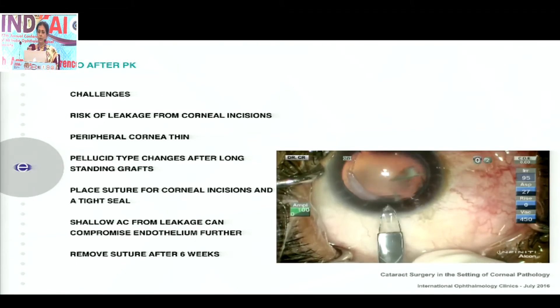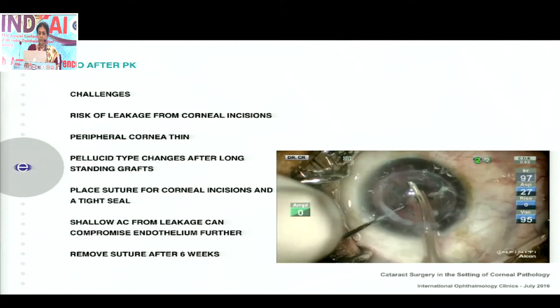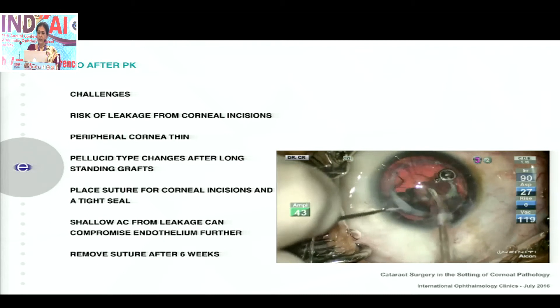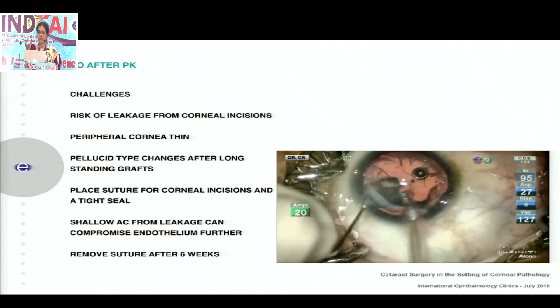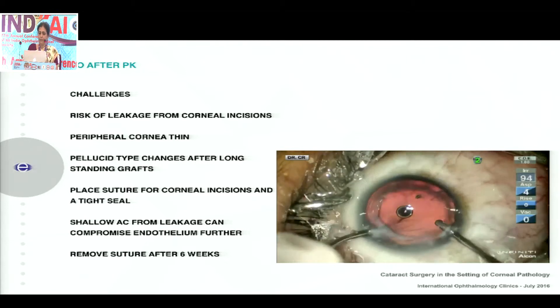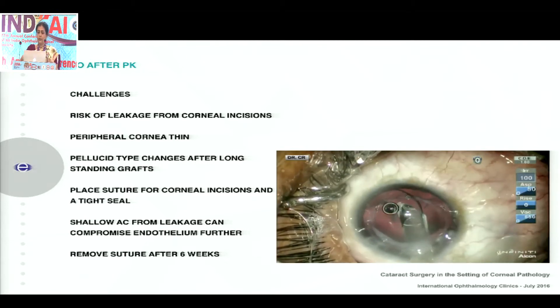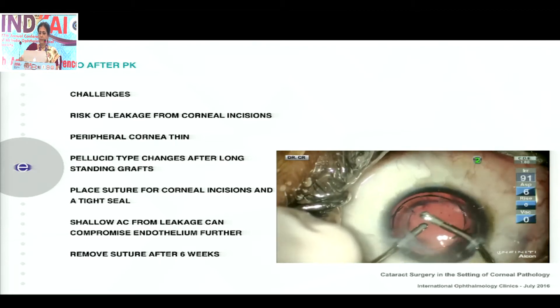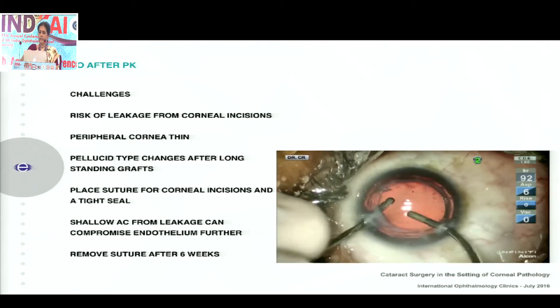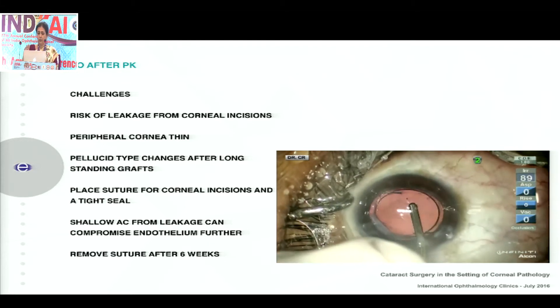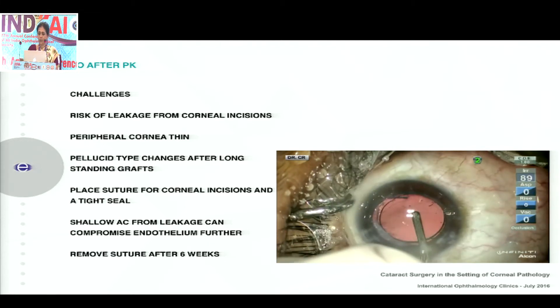When doing phaco in a post-PKP eye, it's important first to make your incision outside the area of the graft, and use a very gentle phacoemulsification to protect the endothelium. Use enough viscoelastic and keep parameters low. Keep in mind that long-standing grafts can have pellucid-type changes. There could be a little wound leakage, so you need to place a suture and remove it after six weeks.